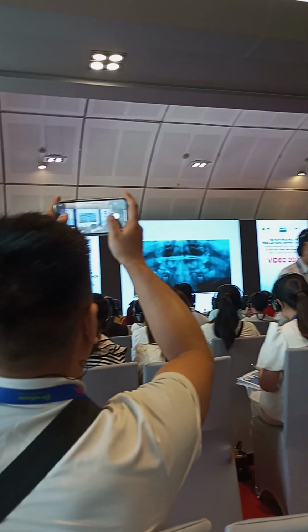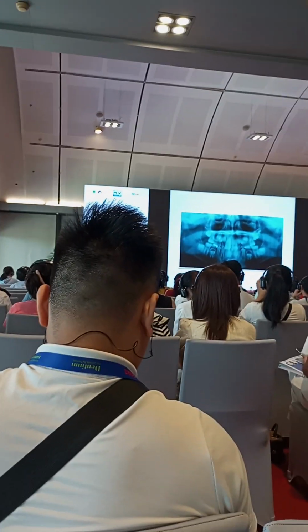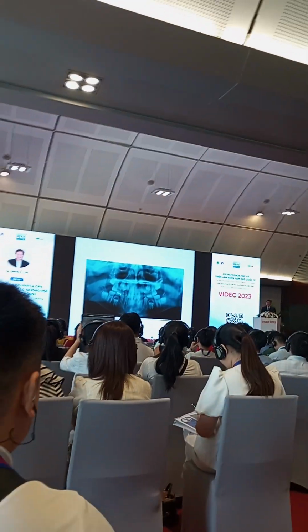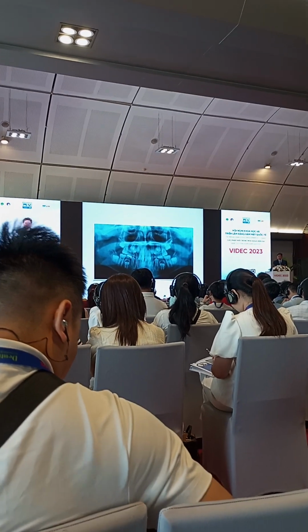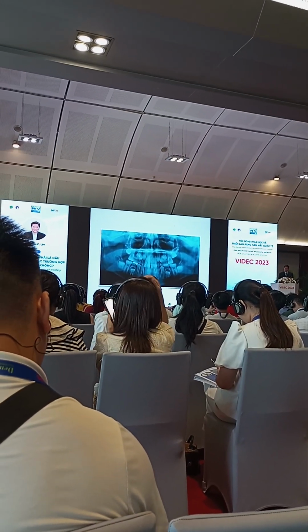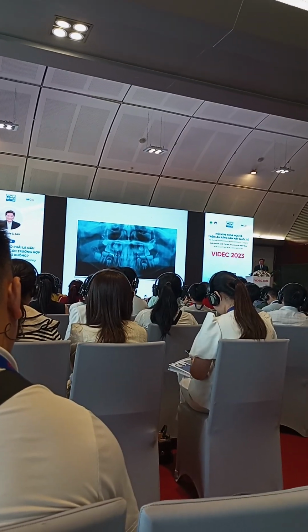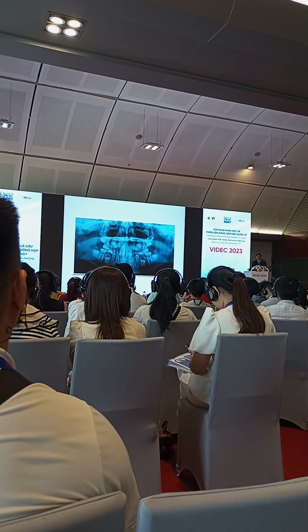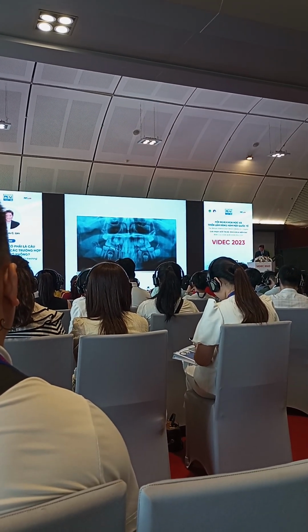In the panoramic, we have all the teeth present, including the third molars. In cases of class 2 skeletal pattern, we are not that concerned about the third molars. But if it is a class 3, we would, as much as possible, have the third molars removed. For class 2 cases, sometimes we can delay the removal of the impacted third molars.